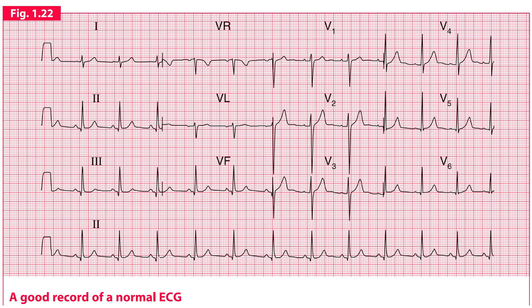This is how a normal ECG looks like. It is recorded from a normal healthy person. You can see that leads 1, 2, and 3 are present in one column.